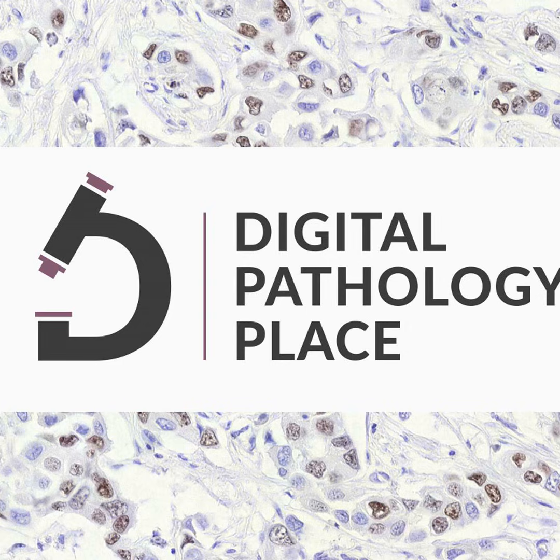And documentation is a keyword I hear from regulatory consultants and everybody who's helping companies do these clinical trials or devices. That is, document from the get-go, because you cannot go back to redocument. It's very challenging to go back, right? You need to document where your training images came from, the different versions, the iterations you might be doing throughout development, making sure you have the right target demographics in your training data for what the clinical trial is going to be. And the sooner you do that and the more data you collect, of course, the stronger and better the model you'll have. But ultimately, you'll be farther along when you move towards that regulatory process.